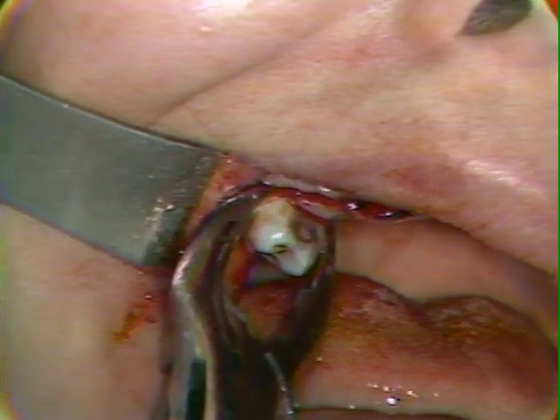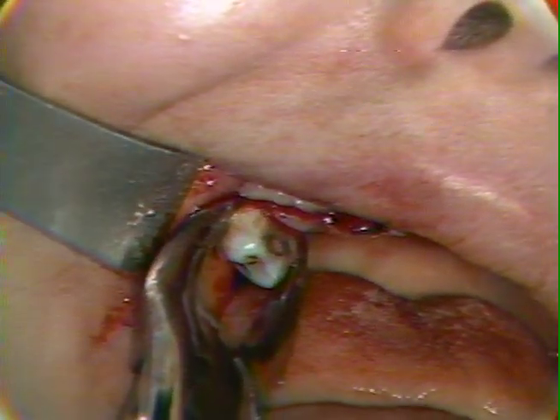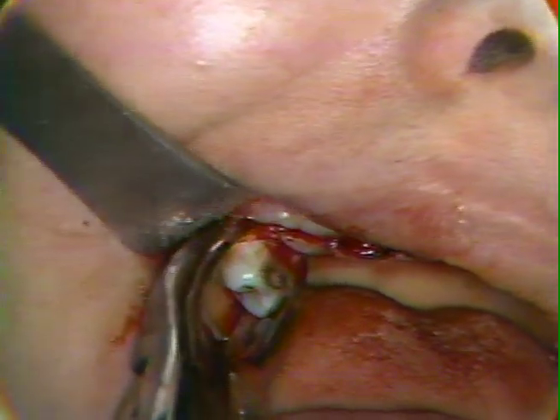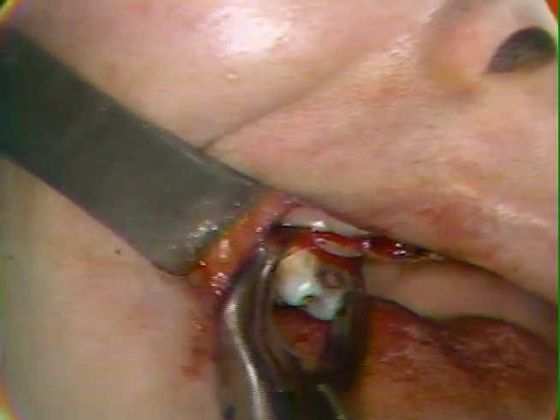Now, if you can open a little bit, please, we'll proceed with the removal of the palatal root. And lots of pressure here for just a moment. So when these teeth have any degree of divergency in the tripod of the several roots, it can be helpful to separate the roots and bring them out in this manner.